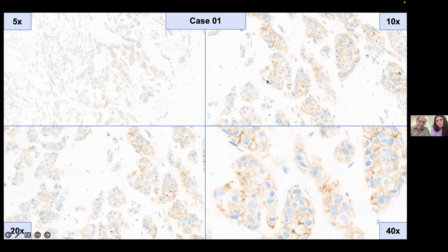It's not. But then this is ×10. Is this ×10? I think they're both similar magnification on the diagonal. It looks pretty similar in any case. I think it is 10. Okay, so this is moderate staining intensity. Definitely moderate. Is it complete? Definitely not. There are gaps everywhere. And remember, you need 10% complete to call it 2+. So it's not the case.